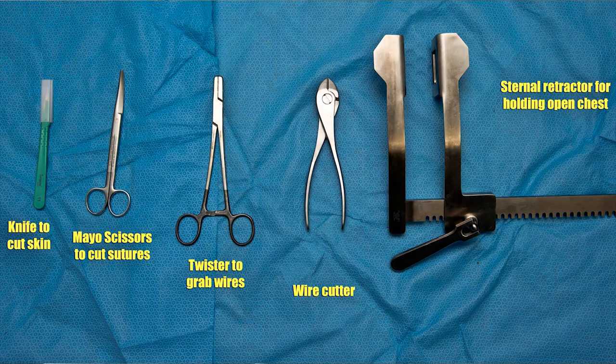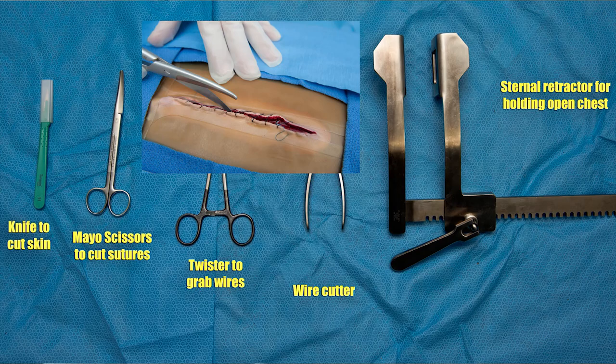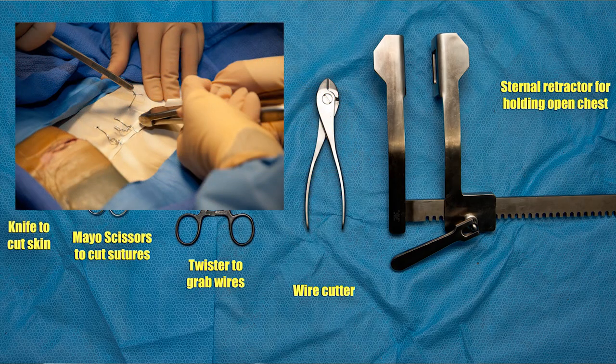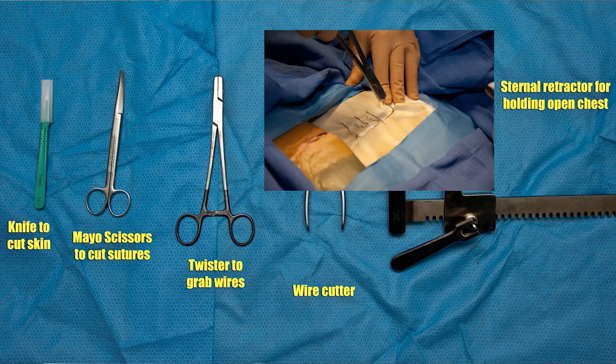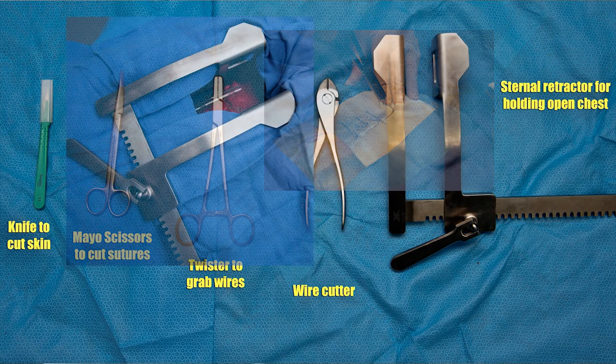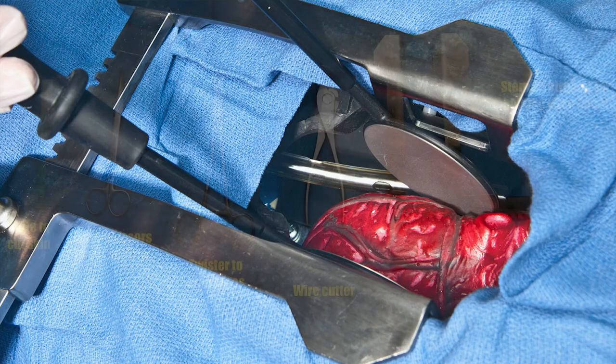I'd like to introduce you to the small set of instruments that will be used to actually get the chest open. Even though you don't need to know the instruments' names by sight, I'm going to explain what each of them does to help you understand the steps of the procedure. The scalpel is needed to re-open the skin. The scissors cuts through the two other layers of suture. The wire cutter is the only instrument that can cut through the wires keeping the sternum closed. The wire twister is used to stabilize and pull out the cut wires. The retractor may then be used to open the sternum, relieving the tamponade or allowing room for internal cardiac massage or defibrillation.